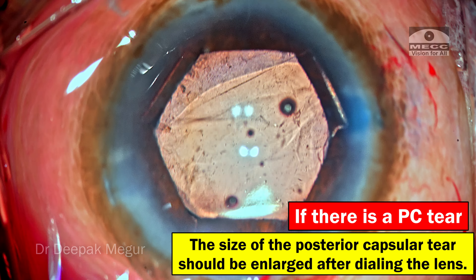When the last part of the CTR has to come into the bag, I ensure that the area of zonular dehiscence is well supported. I dial the CTR to ensure the area in question has adequate support. The CTR is now in place. Examining the capsular bag again, the bag which had displaced toward the center has settled — the crumpled lines are gone and the bag is now well supported, confirming the diagnosis of localized intraoperative zonular dehiscence.